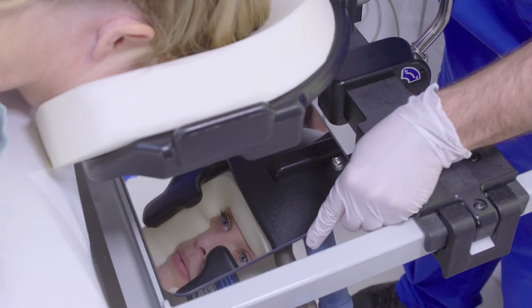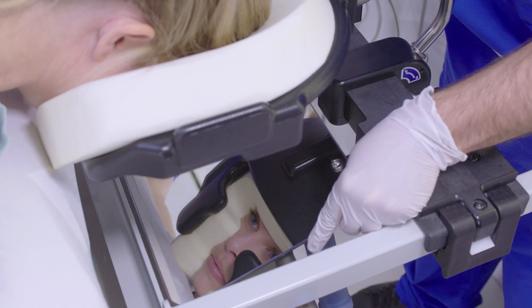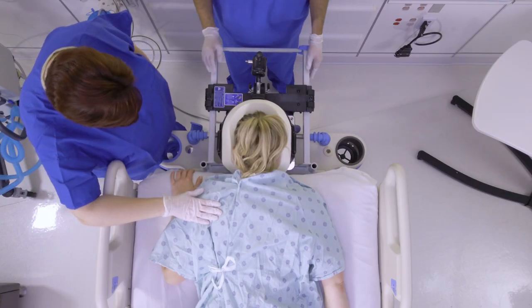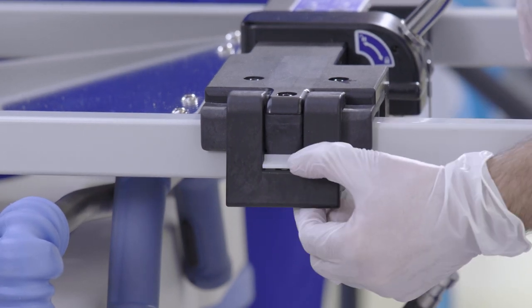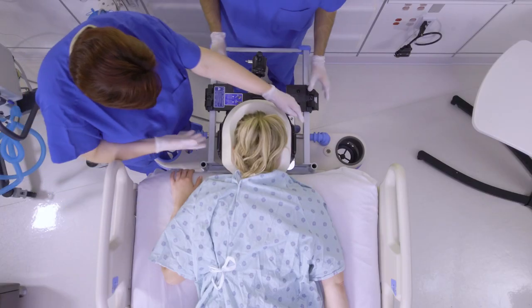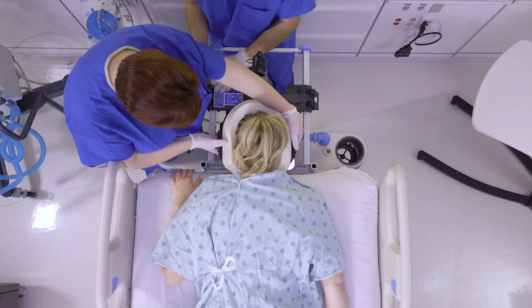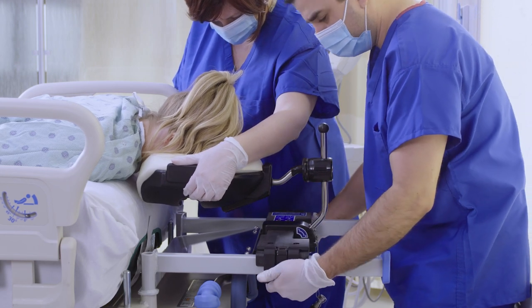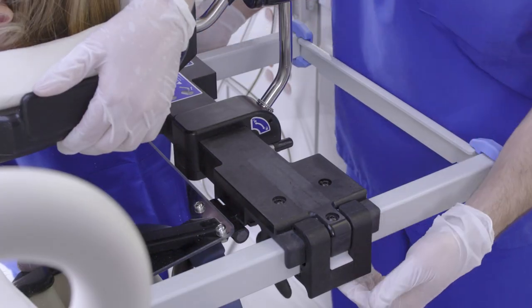First, rotate the mirror to gain visibility to the patient's face. Then, position the patient's face by unlocking the slide clamps. Press down on the white clamp locks to release, and then move the head support on the frame. Make sure the patient's eyes are free from any contact and the face is supported. When set, lock the slide clamps.